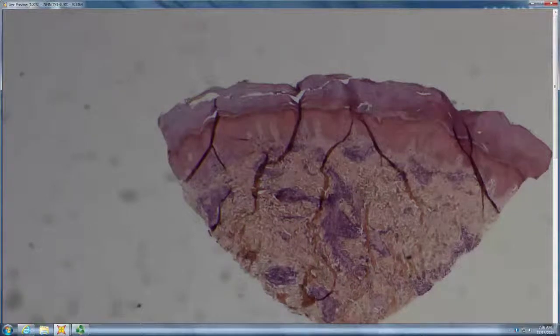What's this thing, where you've got all these red eosinophil granules on the collagen? Is that a flame figure? That's a flame figure, right? Is there any granuloma surrounding the flame figure? No. If there's granuloma surrounding the flame figure, what do you have? Churg-Strauss. In the absence of granuloma, then it's Wells.